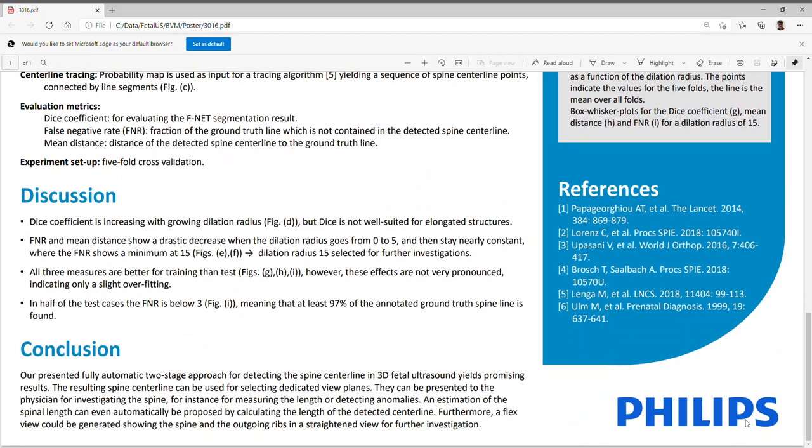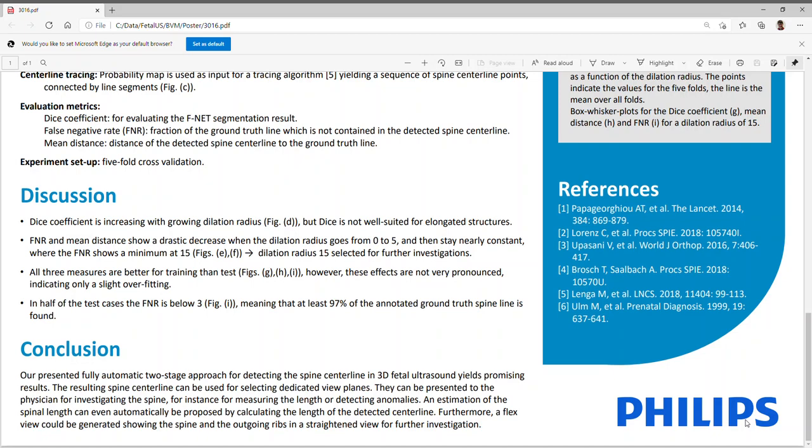Hence, our presented fully automatic two-stage approach for detecting the spine centerline in 3D fetal ultrasound scans yields promising results. The resulting spine centerline can be used for selecting dedicated view planes. They can be presented to the physician for investigating the spine, for instance, for measuring the length or detecting anomalies. An estimation of the spine length can even automatically be proposed by calculating the length of the detected centerline. Furthermore, a flex view could be generated, showing the spine and the outgoing ribs in the straightened view for further investigation.